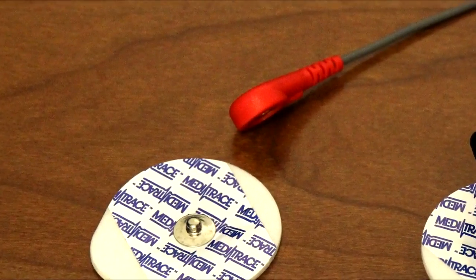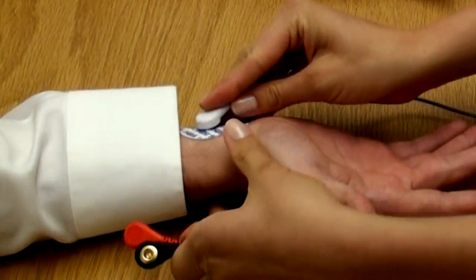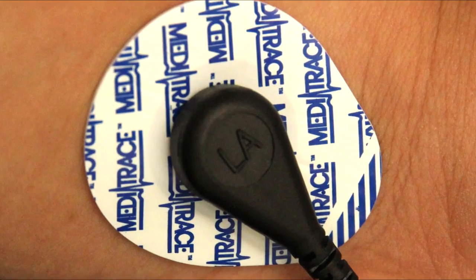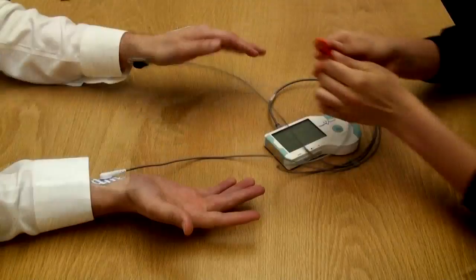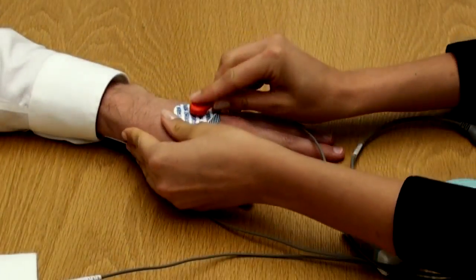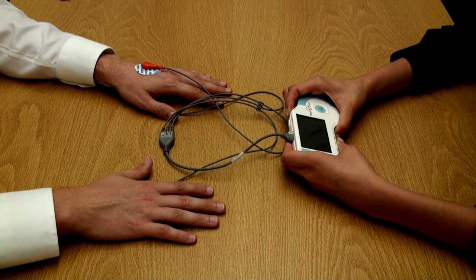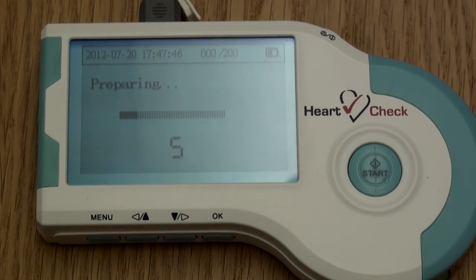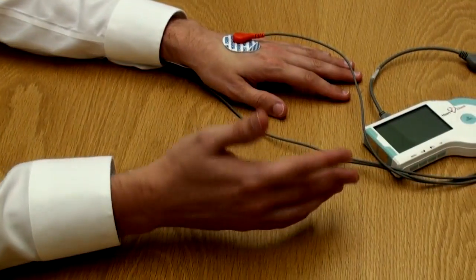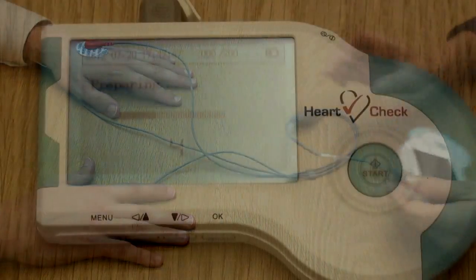Once the lead wires are connected, attach them to the electrodes by simply snapping them into place. Attach the white lead wire, labeled RA for right arm, to the electrode on the patient's right wrist. Then, attach the black lead wire, labeled LA for left arm, to the electrode on the patient's left wrist. Finally, attach the red lead wire, labeled LL for left leg, to the electrode on the back of the patient's left hand. Once connected, press the power button to power on the device, then press the start button to enter the preparation stage. Have the patient rest their elbows on a sturdy surface such as a table to help produce a cleaner ECG waveform.